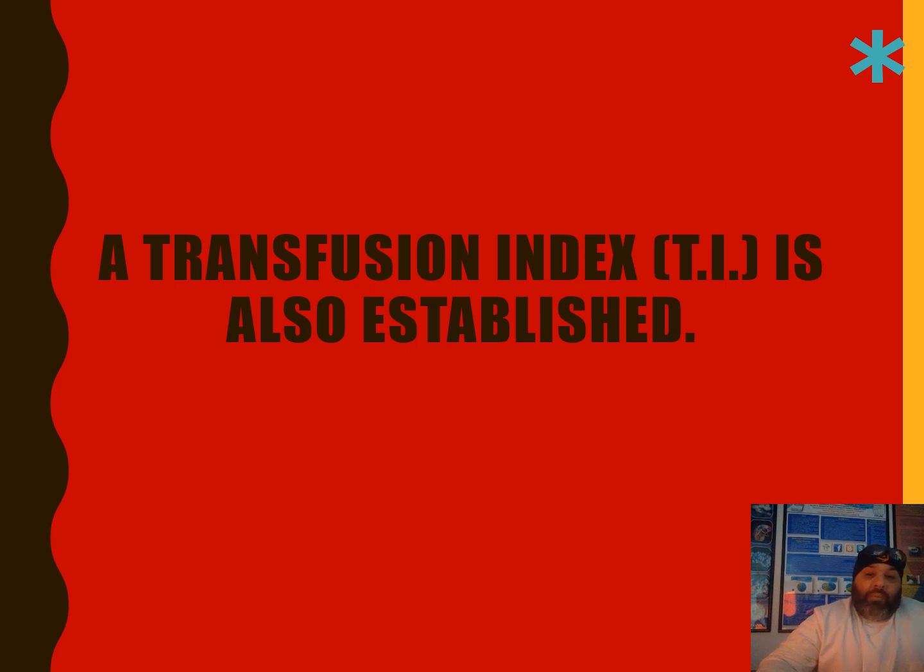And so generally speaking, all transfusion laboratories have a particular quota around the transfusion index, and so this relates also, apart from practice, to safety and safe practice around transfusion laboratories.